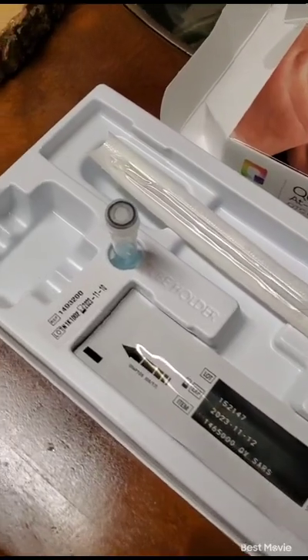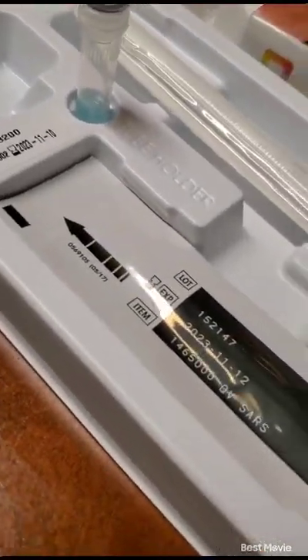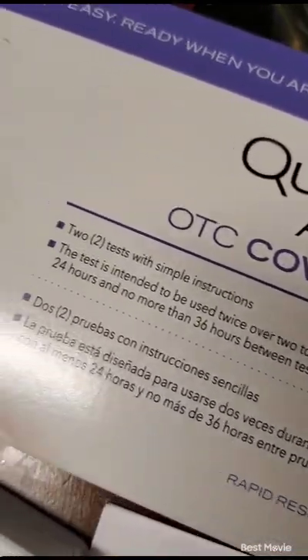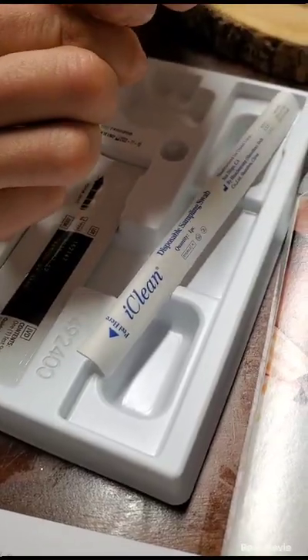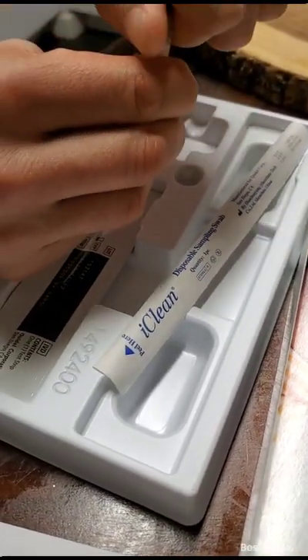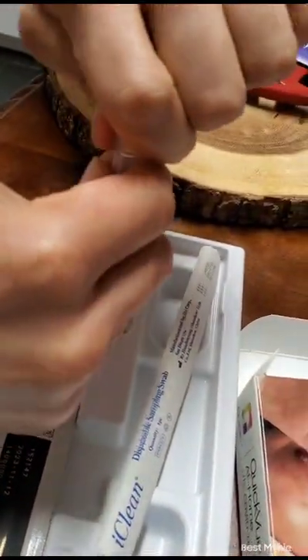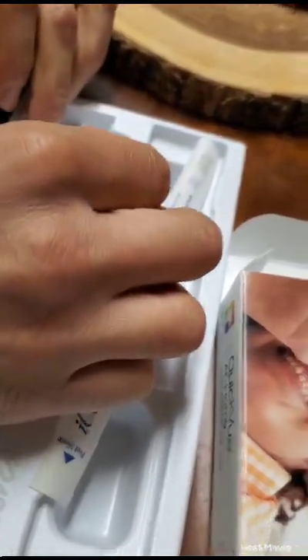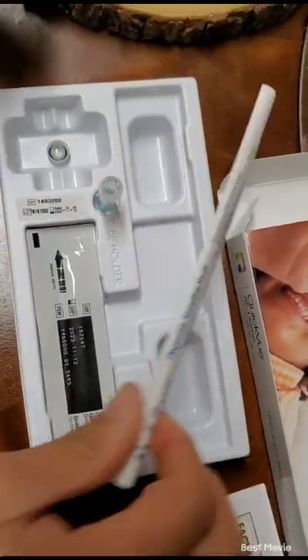Hi guys, so today we will be showing you how to take an at-home COVID test. This is the brand we are using. So what are we doing first? You open this tube right here, place that tube right there, and take out the swab.